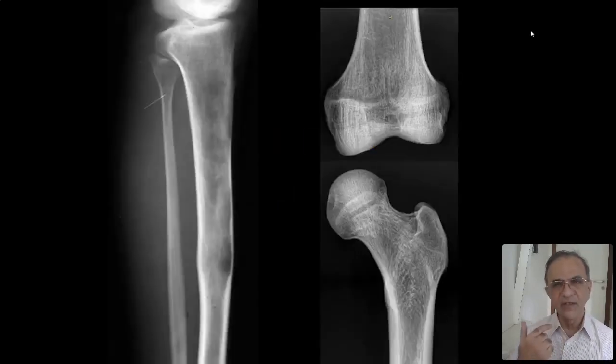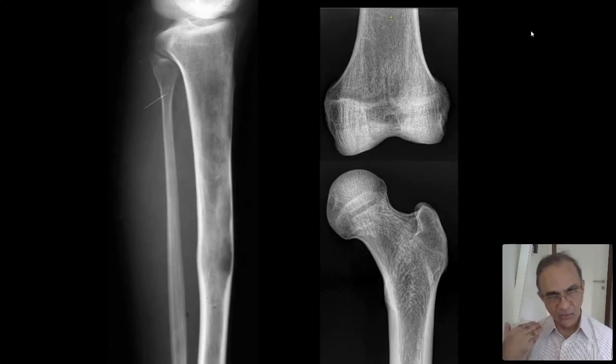Now, this is very interesting. Okay, if there are residents here, I want you to carefully listen to what I'm saying. It has nothing to do with skeletal dysplasia. It has everything to do with what you are as a physician, as a resident, as somebody who is learning, and somebody who wants to teach. On the left is an abnormal human bone. What I mean by human bone is an in vivo X-ray or a radiograph, if you will. On the right are pictures of dry bone, of femur.